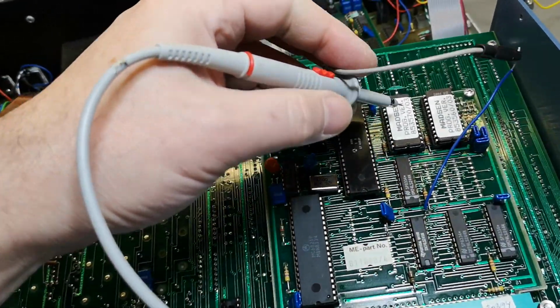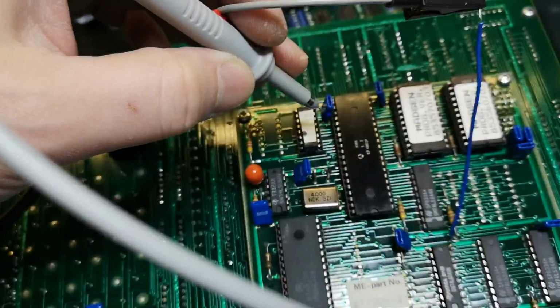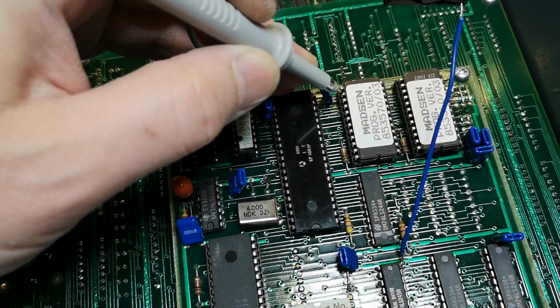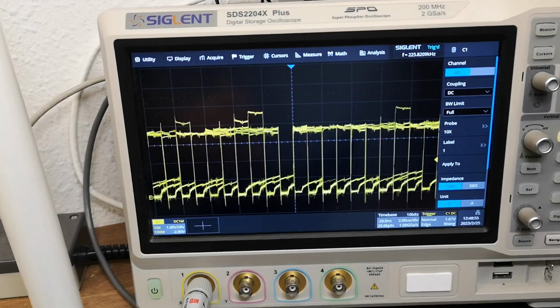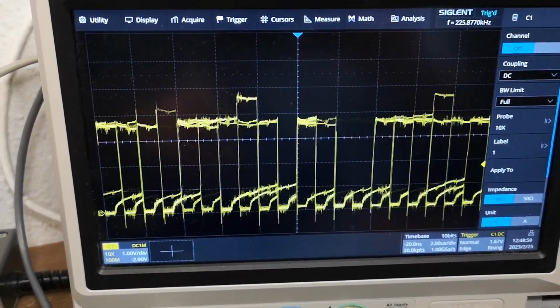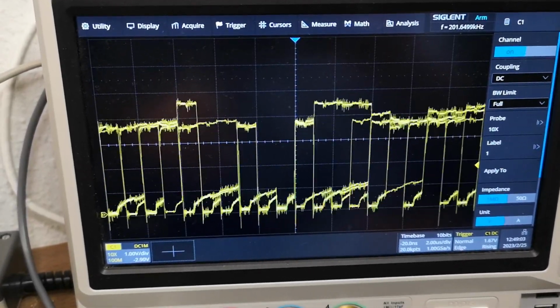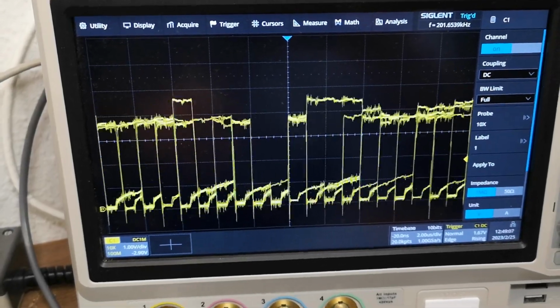I've been measuring a little bit around here on the different data lines and chip enable signals and all that kind of stuff. And it is quite evident that the system is up and running. Look at the different level problems. It's very, very clear that they got signal integrity issues. Oh, look at that, it's so bad.